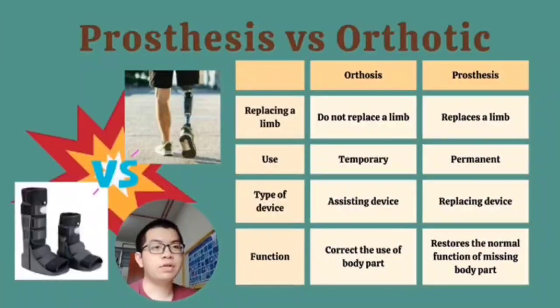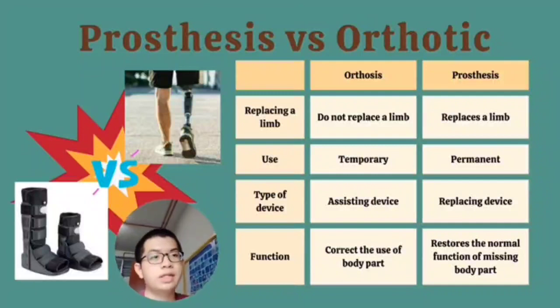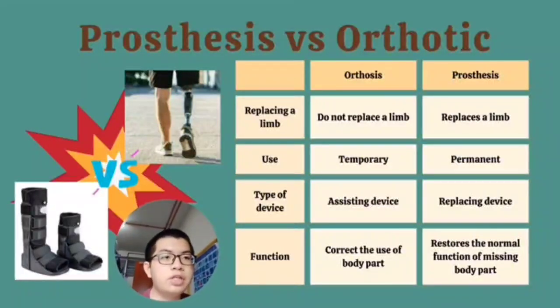Even though people first think of prosthetics as being about amputation, there are still people who get confused that prosthetic and orthotic are the same, due to the function of prosthesis and orthosis in helping patients that have difficulty of locomotion due to deficiency or deformities. But unfortunately, these two medical devices are exactly different.